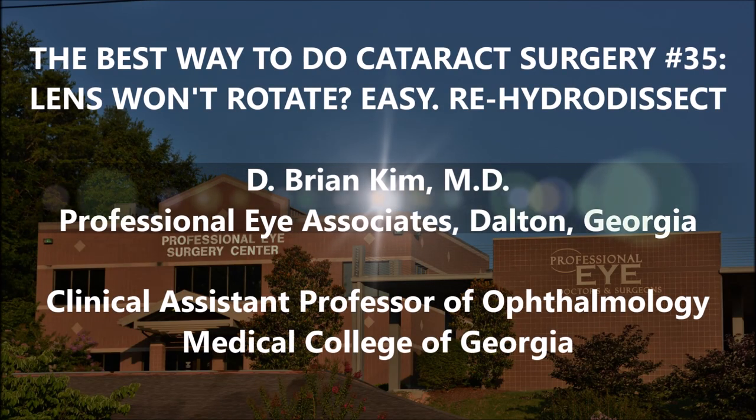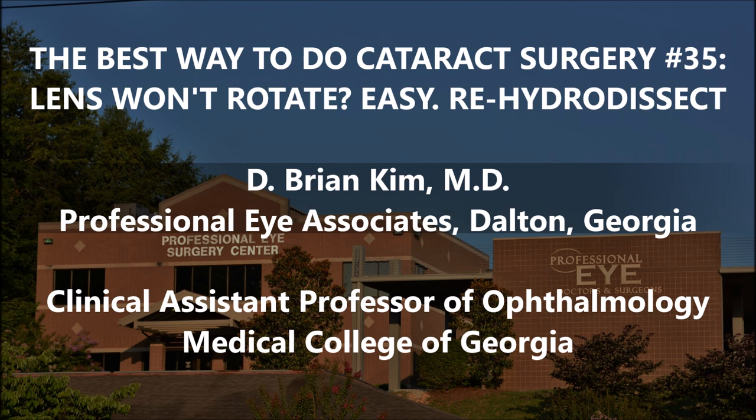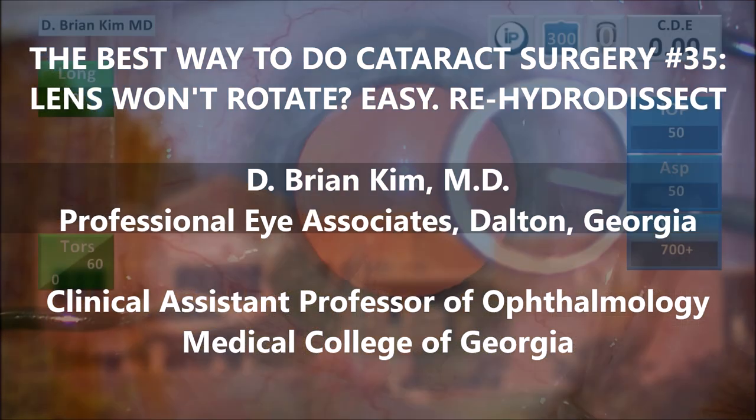Hi, this is Brian Kim. I'm going to share with you case number 35 in the best way to do cataract surgery series. This is a moderately dense lens, and after I remove the first half, you're going to see I'm having trouble rotating the second half — this is despite good hydrodissection and spinning of the lens. You're going to see an easy way to mobilize the lens, and I will show you in my opinion the best way to do cataract surgery in the most efficient and safe way possible.